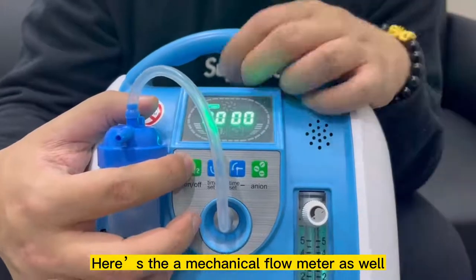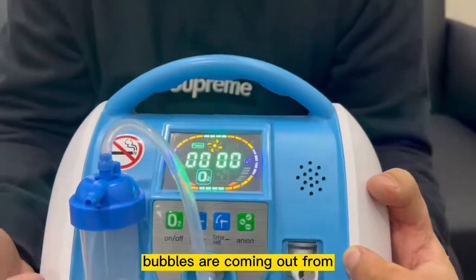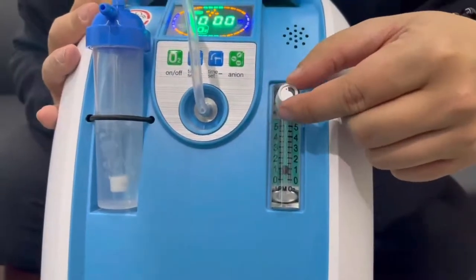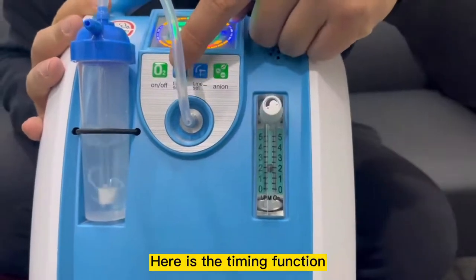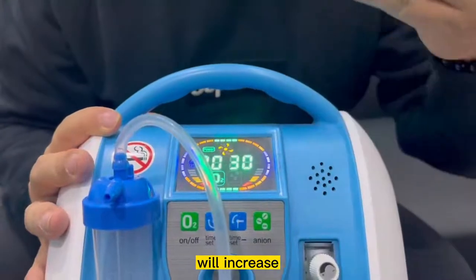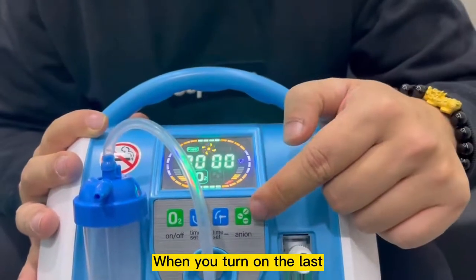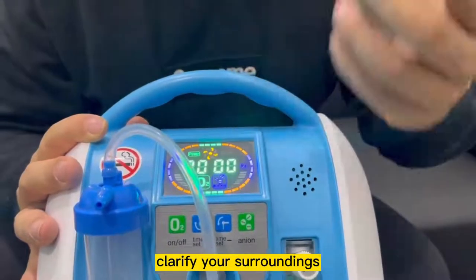The mechanical flow meter as well. When you turn on, it will start operating and you'll see that bubbles are coming out from the output of our humidifier bottle. You can just adjust the flow rates from 1 to 5 liters. Here is the timing function — the timing will increase at an interval of 15 minutes up to 8 hours; this is plus, this is minus. We'll turn on the last function, our ionizer function. The ionizer function will actually light up, showing that it is helping you to purify your surroundings.